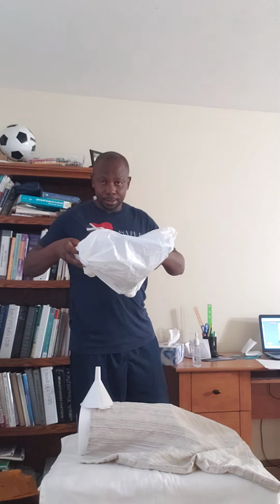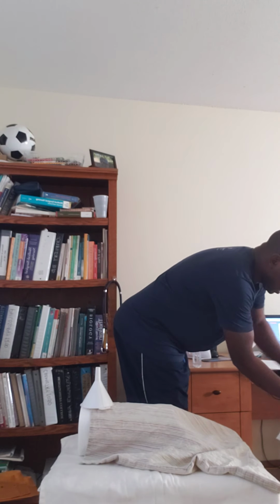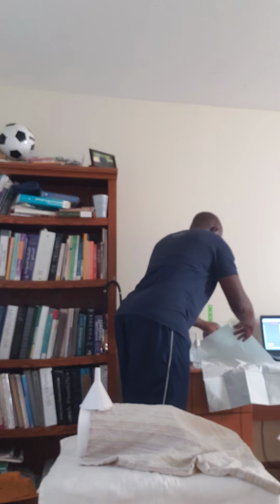This is my kit, my first kit. What I'm going to do is use this one to prepare my sterile area.